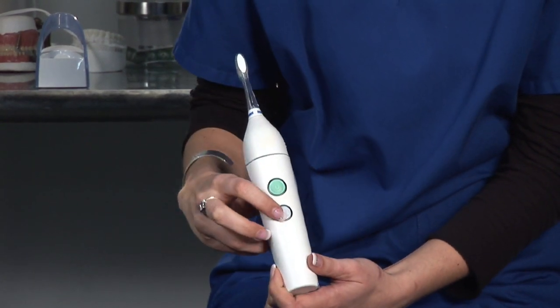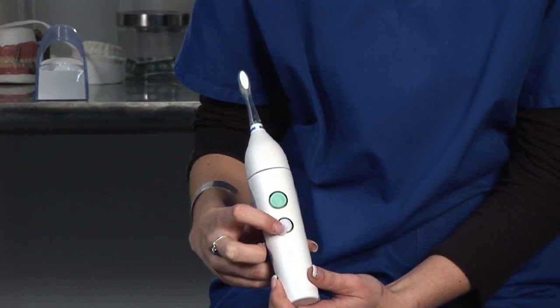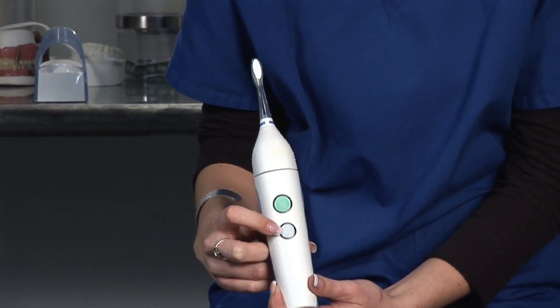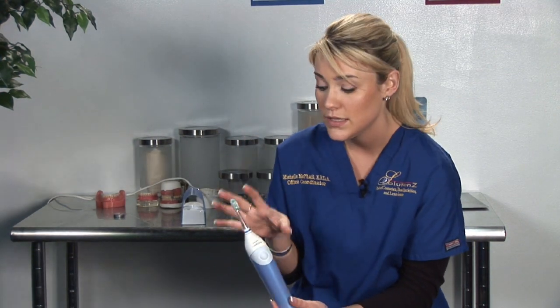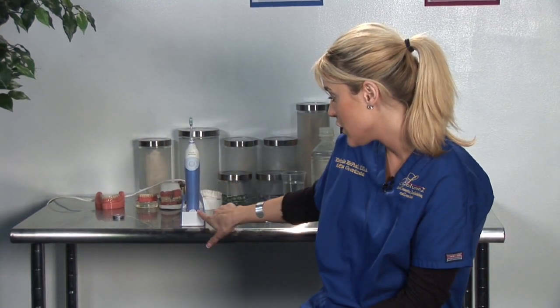The same button you use to turn it on and off, and the button below, will set it on a different timer. Once you're finished using your Sonicare toothbrush, you always want to make sure you rinse off the bristles, clean it really well, and then place it back on the charger so it can continue to charge.